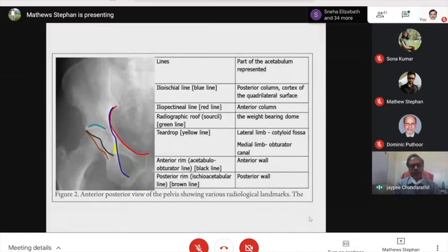And then you are asking for an X-ray of the pelvis. For a trauma lesion, yes, but for other lesions, you must probably ask the patient. If it is not an acute emergency, then probably it is better to get the bowel evacuated and then get a proper X-ray, so that you may not miss something in the sacrum, symphysis pubis, etc., because of the overlying gas shadows. That is another point which should not be forgotten. And you should try to read the X-rays systematically from one end to the other, so that it can be compared. These are some of the few points which I wanted to add on.